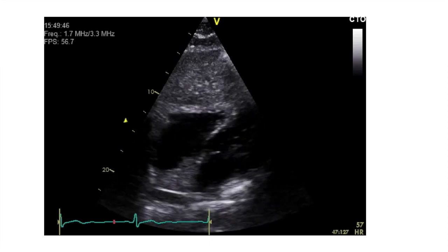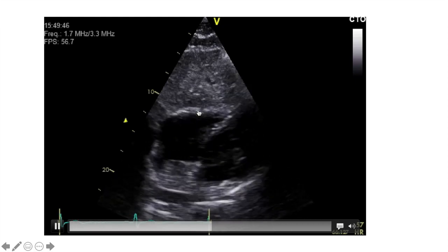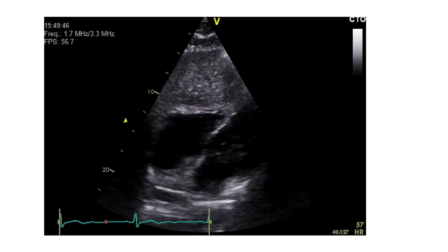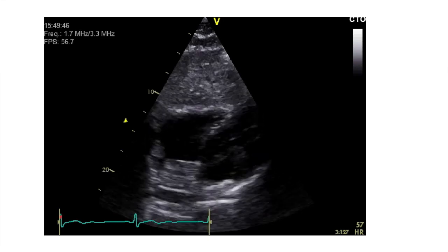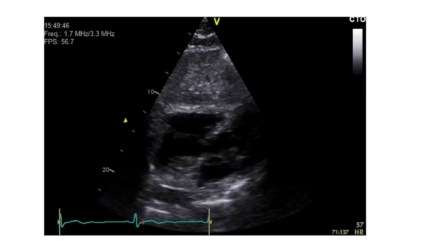The second thing that's very useful for is to look at the right ventricular free wall thickness. This is it right here. Because the right ventricular free wall is perpendicular to the ultrasound beam, it's imaged very well. And therefore you can have a look at the right ventricle to see if it's thick. If it's thick, it implies the right ventricle has been exposed to a chronic afterload problem, such as pulmonary hypertension. And therefore there is a chronic disease process affecting the right ventricle going on. The normal width is around ½ centimeter, so anything greater than this at the end of diastole would imply a right ventricular hypertrophy state.